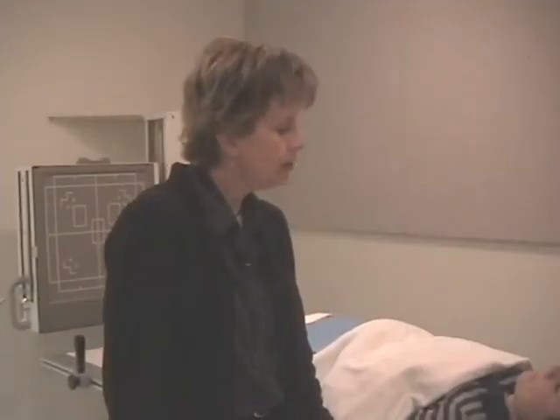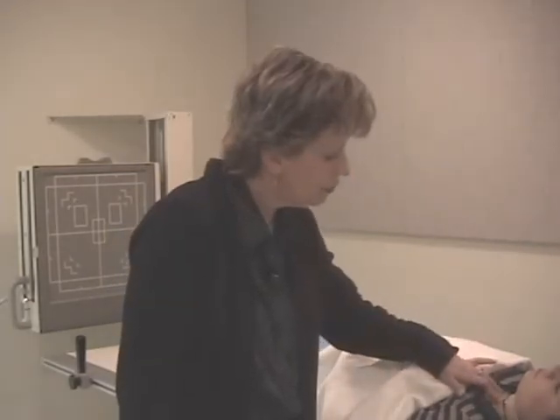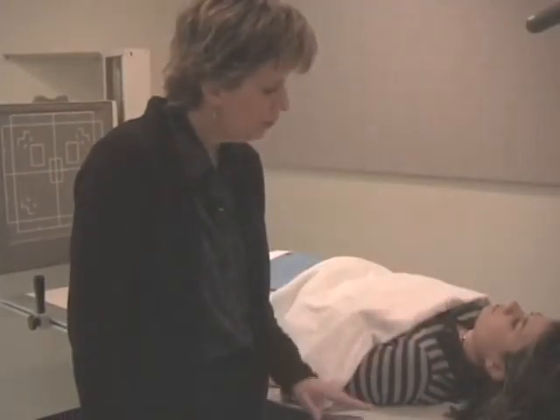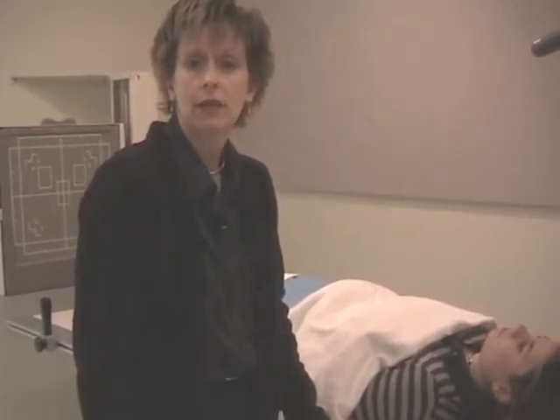So I'll be back. I have our patient set up pretty much for us to accomplish our AP axial position for a skull procedure. I will remind you that our patient does not have any false teeth or earrings. I actually would be a little bit concerned about this choker for this particular projection because the tube is going to throw things down. So I might remove this necklace. Contact lenses, if possible, should be removed, but that's not always the case. Definitely eyeglasses will need to come off.